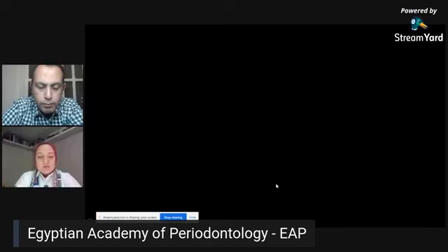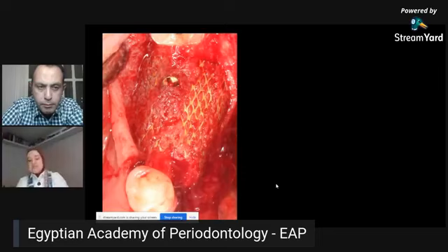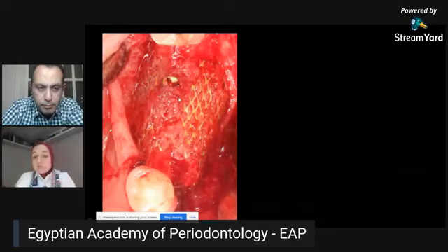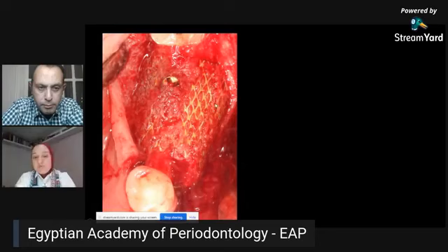After having the cone beam, we go back to remove our titanium mesh. And this is one of the pleasant moments, really. I'm kidding, it's not pleasant at all, because titanium mesh removal is really one of the tough procedures. It's usually integrated with the bone below it and with the soft tissue above it. And you have this layer that you can call a pseudo-periosteal layer, which was well documented in the literature, because of the invasion of soft tissue from the flap into the pores of the mesh itself. So usually the mesh is integrated so hard with the coagulum and the structures that are being regenerated.